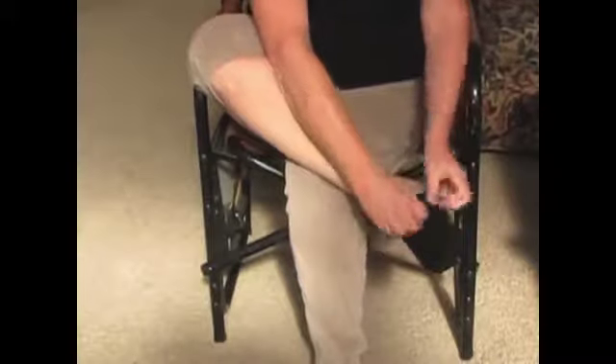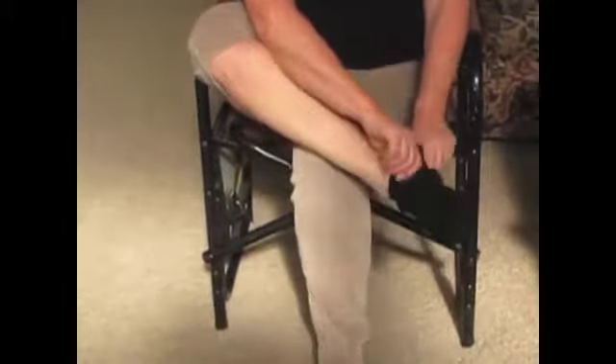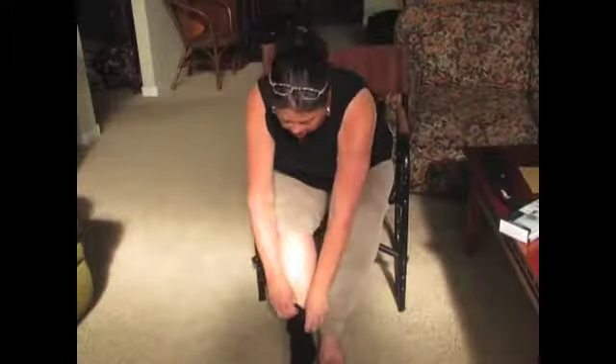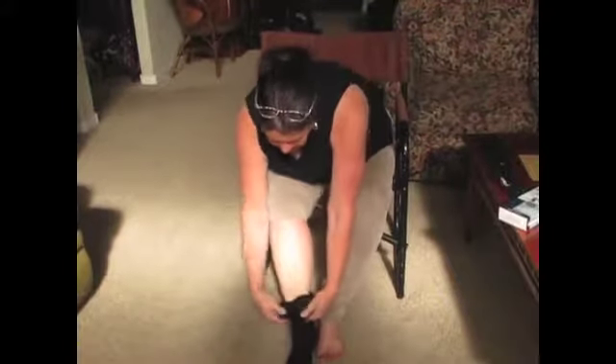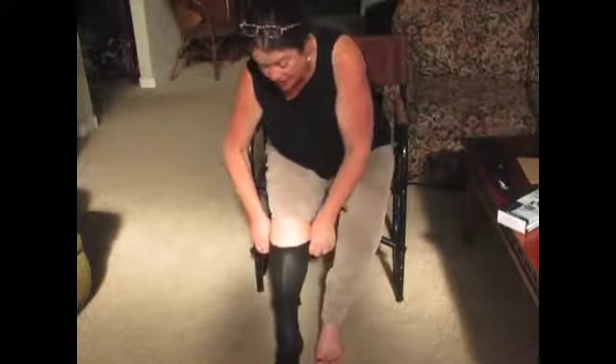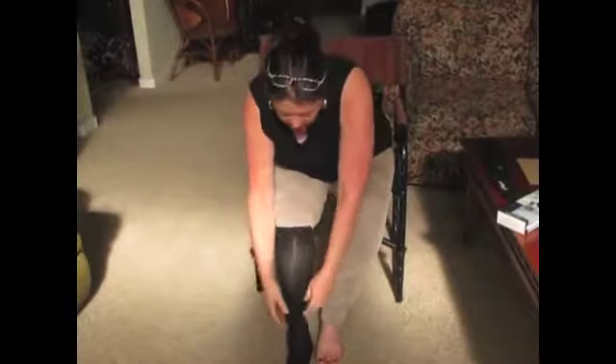The travel sock compression starts about mid-foot and goes all the way up the calf. So if you're an international traveler, have trouble with circulation or diabetes, this is a great sock to use because it will keep the blood circulating all day.